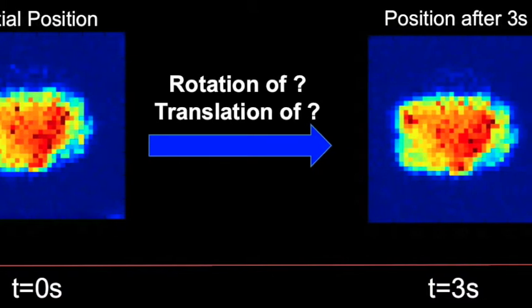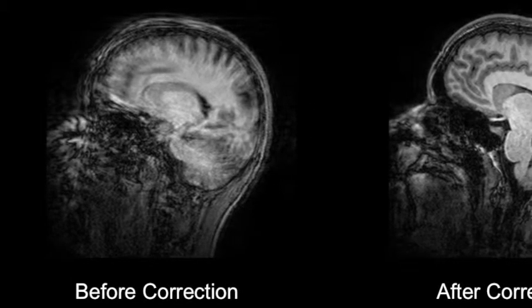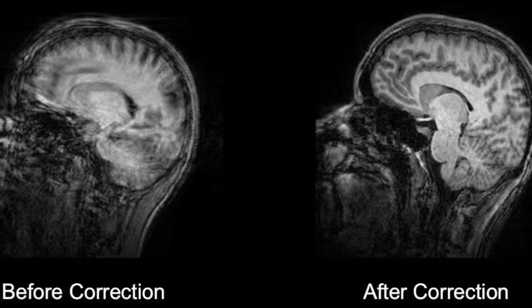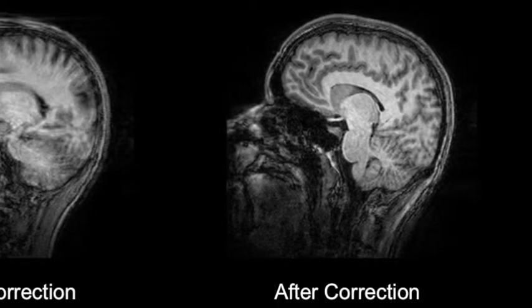Motion detection can be achieved by registering time series volumes. When motion has been detected, the scanner can then respond to subject motion in real time by updating the image coordinates to follow the subject's head. The most important step in motion correction is to be able to accurately register time series volumes.